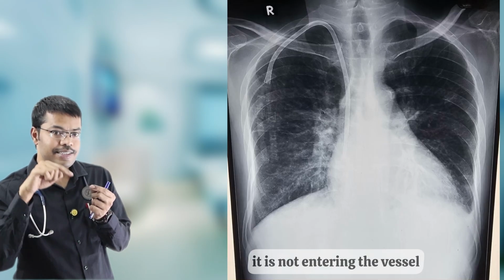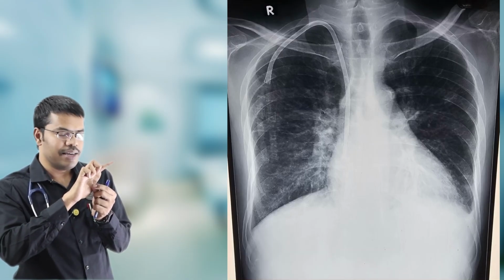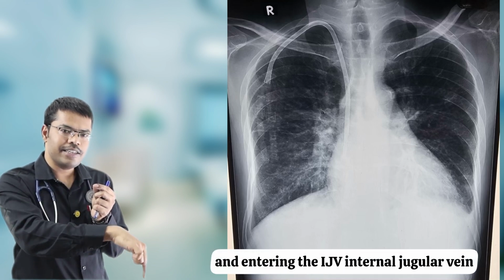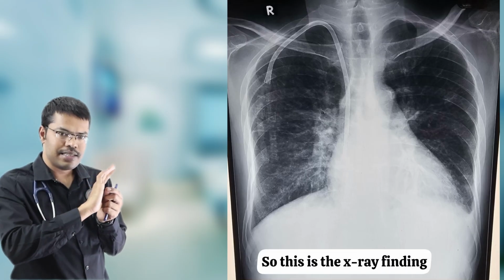It is entering the skin, it is not entering the vessel. It is going in the subcutaneous plane. It is taking a U-turn above the clavicle and entering the IJV, internal jugular vein. So this is the X-ray finding.